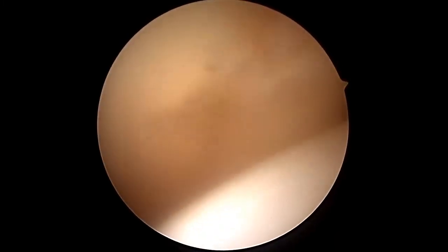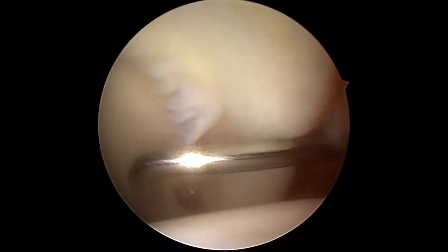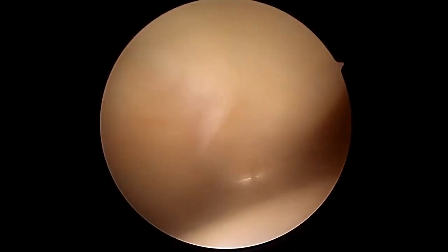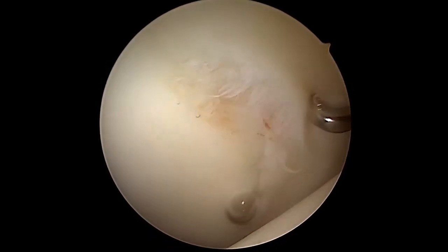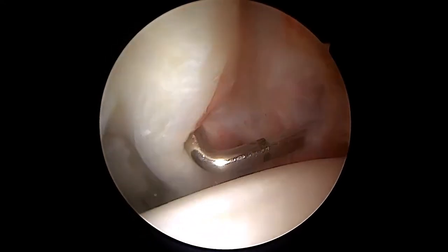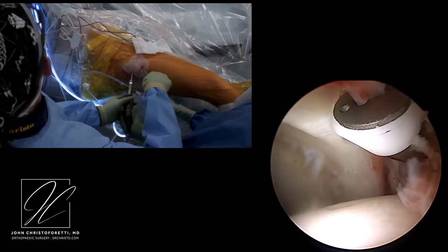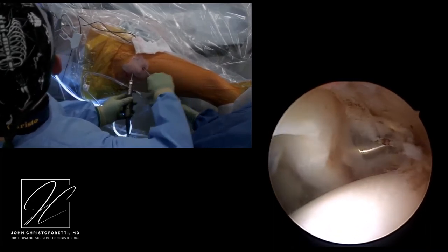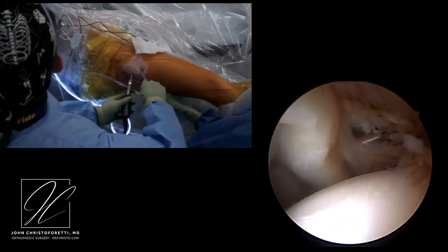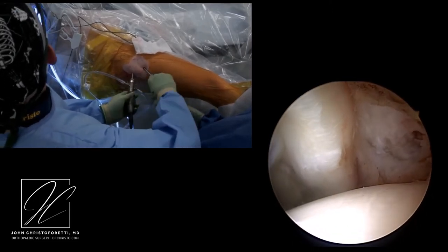This video takes us through an arthroscopic labral repair. This is a right hip viewed from the anterolateral portal. The probe is entered from the mid-anterior portal demonstrating a hypertrophic labrum with a tear at the base chondrolabral juncture tissue with a base of fibrocartilage. The synovitis reaction is obvious. The mid-anterior portal is used to perform synovectomy through a very small periportal capsulotomy. The outside view demonstrates rim preparation of the labrum with a ball rasp, showing the vigorous mechanical debridement possible in a non-acetabuloplasty setting.